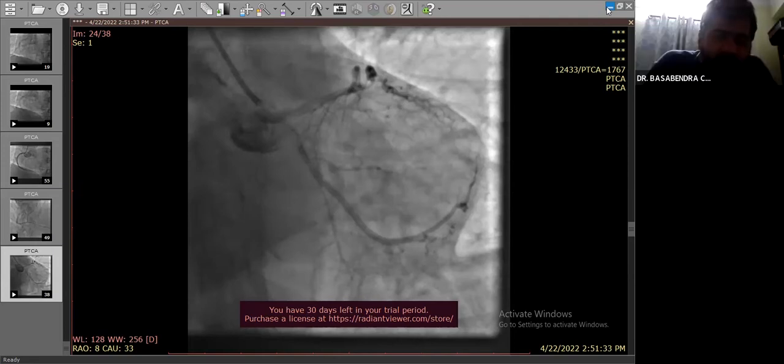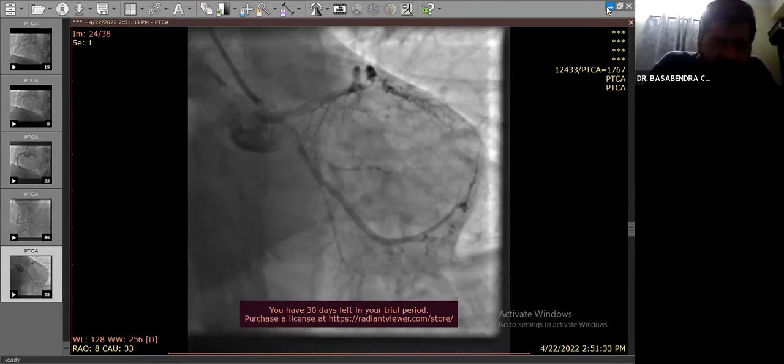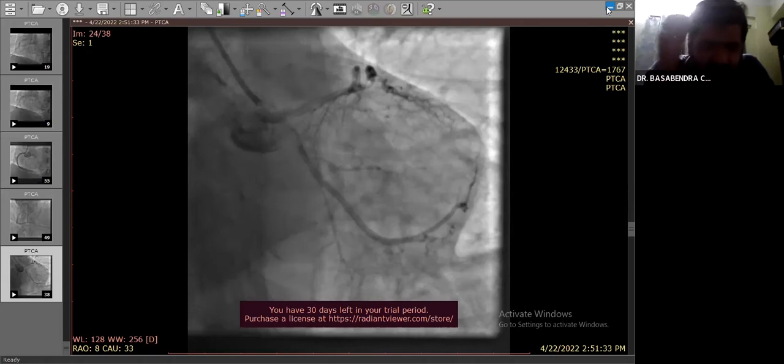Actually, the first check shot was done just after the retrieval. So at the end, we just wanted to make sure that there was no injury to the LAD. Basically, the tip from the left main was in the LAD, because the balloon was inflated in the LAD. The left main had a fair caliber, but the LAD proximal part was diseased. And at that point, we had inflated the balloon, although at a low pressure.